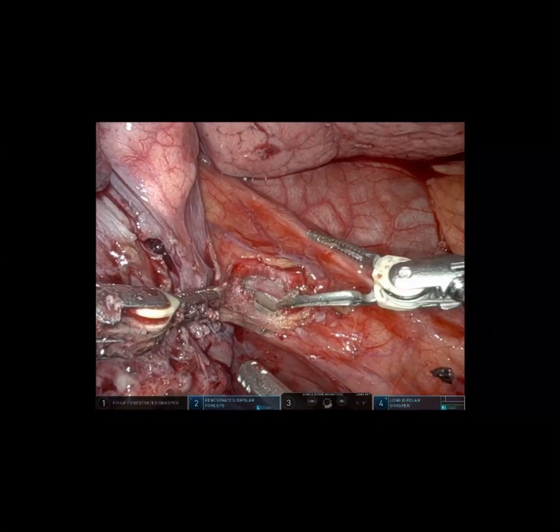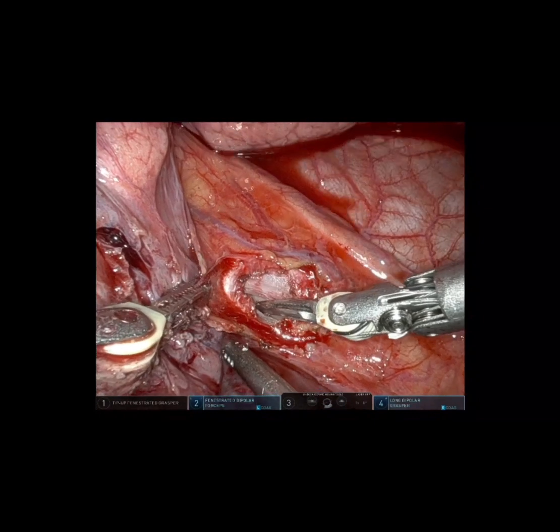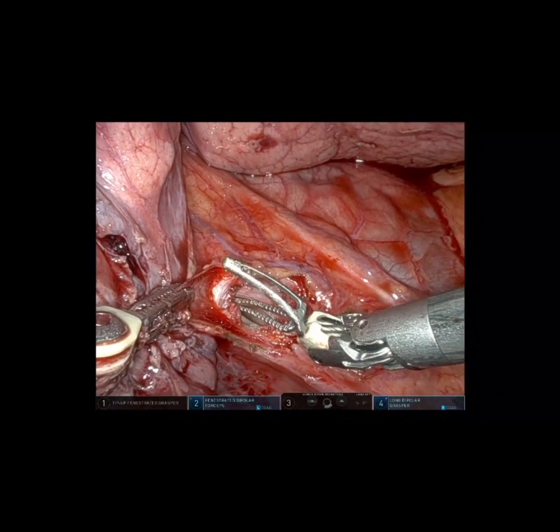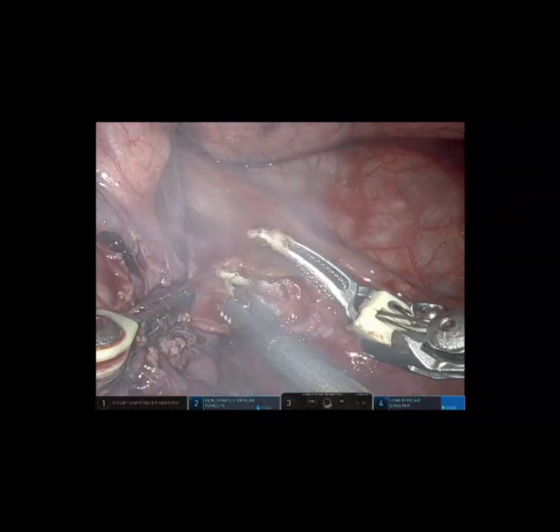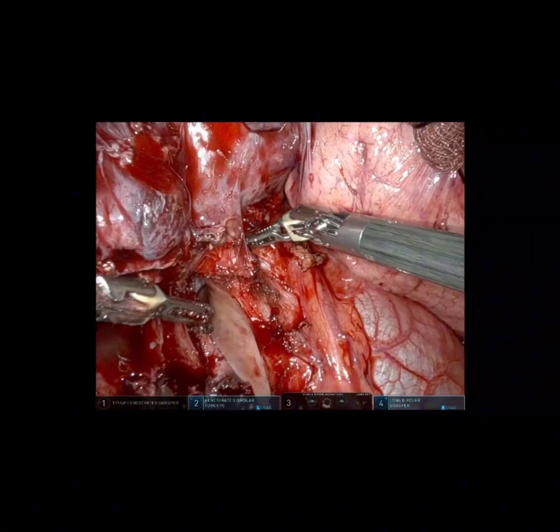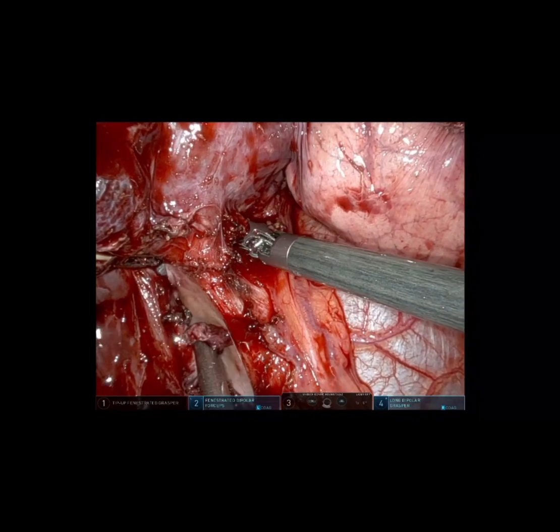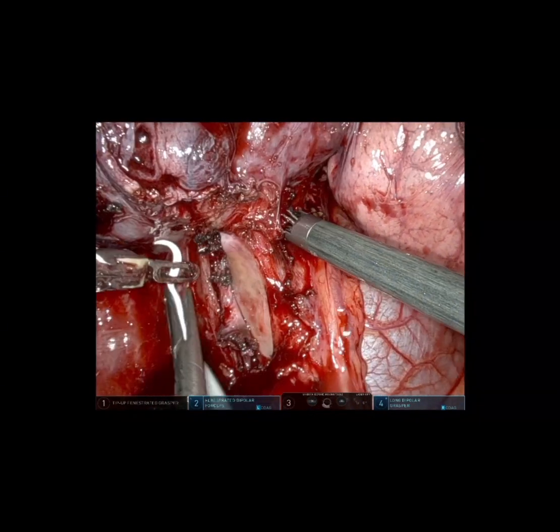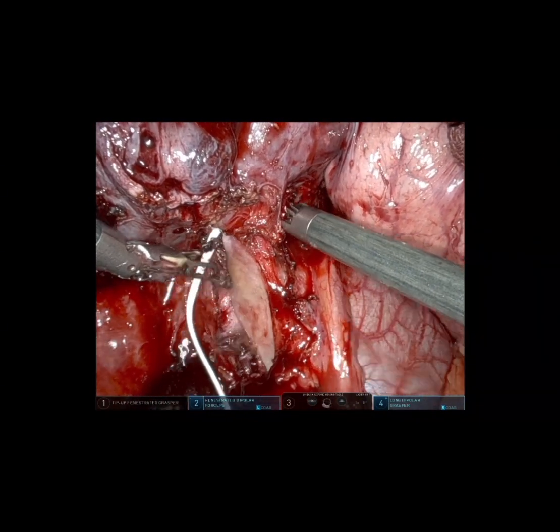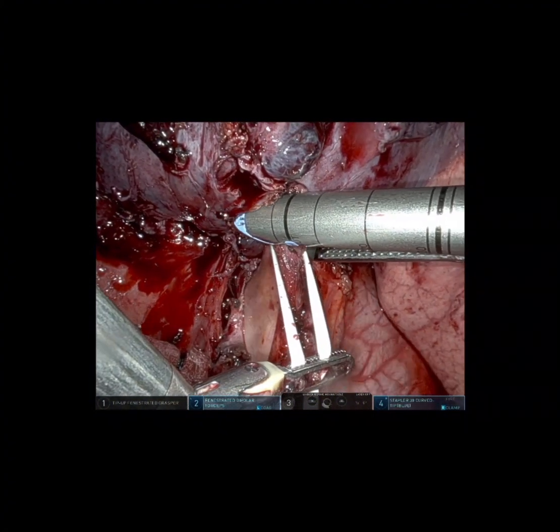Now, you've heard me talk many times. We don't like to take the veins first until we do the fissure and everything else because of congestion. Here you have no choice. And if there's massive hemoptysis, you divide the airway first. But his hemoptysis wasn't bad. We bronched him. We cleaned him out. Single lumen went to double. And he's not really bleeding. So we're out of his mouth. There's pus coming out. So we're going to take the veins and artery before the bronchus.